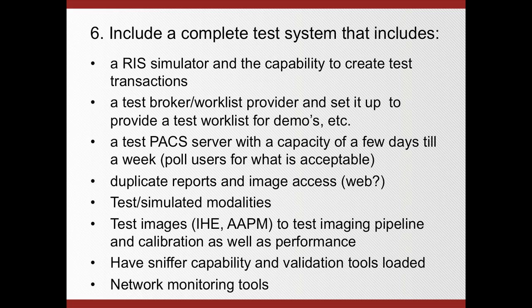the modality. And then also, if you have a vendor that might want to come in to do a demo of the latest and greatest product, for example for a week, you want to have the capability to pull down a test worklist to test that component as well. So get a test broker, test worklist, and have it set up to provide the test worklists. And obviously you need to have a test PACS server, but you don't necessarily need a lot of capacity, maybe just a few days or a week.